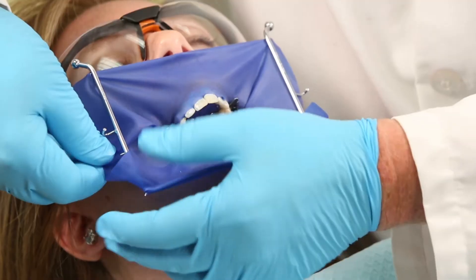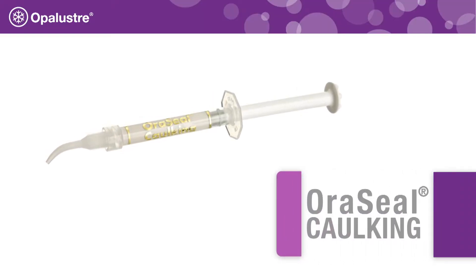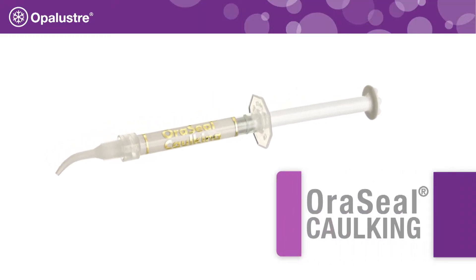Apply the rubber dam, attaching to the frame and inverting the dam at the gingival border. For additional protection, use OraSeal caulking to prevent tissue damage.